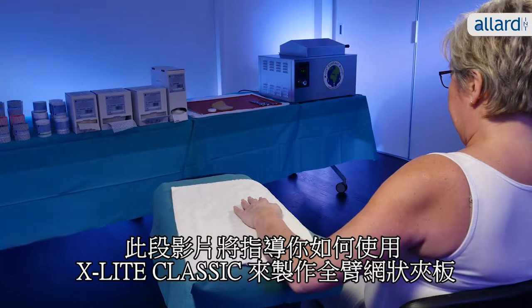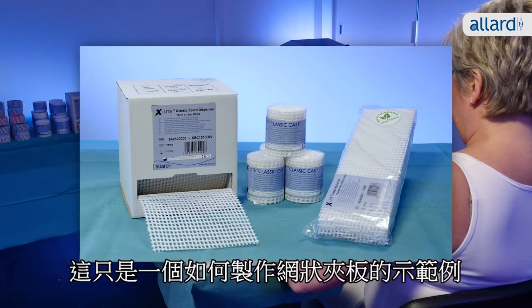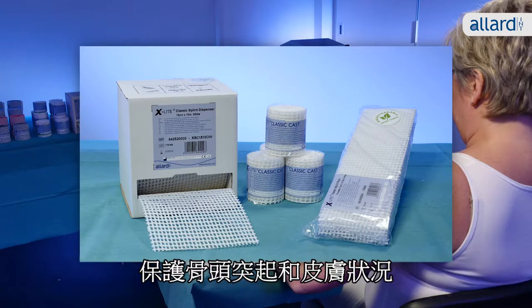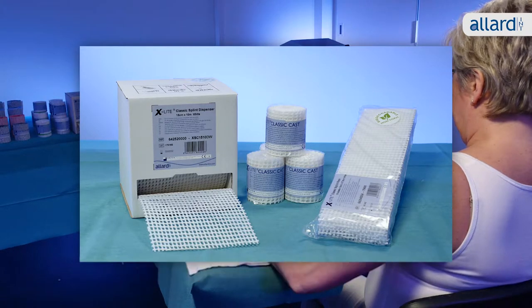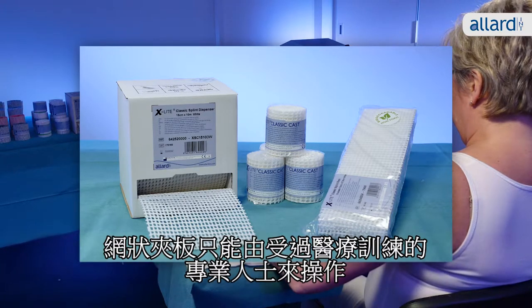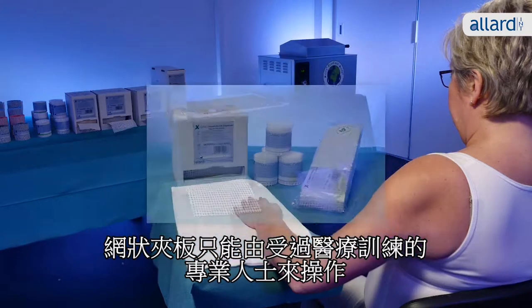This illustration will guide you through how to make a full arm splint in X-Lite Classic. However, this is only an example of how to make the splint. Make sure to always evaluate the individual patient's need for support, protection of bony prominences, and skin condition or wounds that might require extra attention. The splint should only be applied by professional medically trained persons.